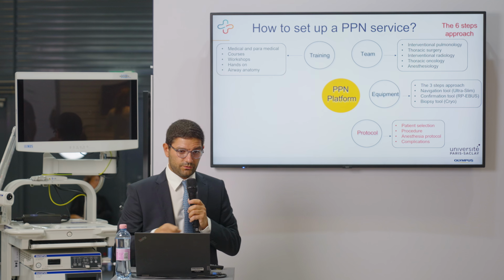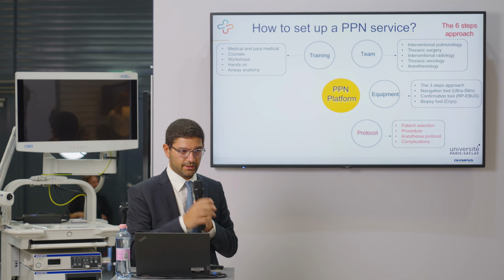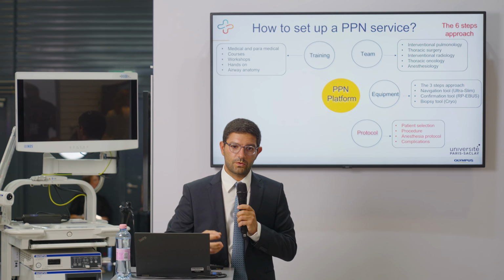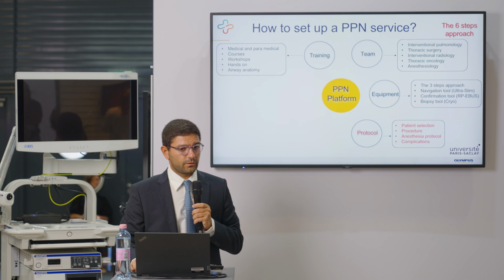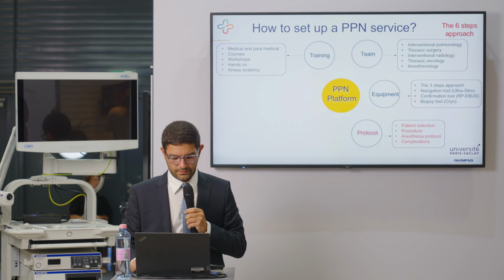You need to write down your protocols for patient selection, for the procedure, and the anesthesia protocol, because we know that anesthesia protocols play a major role in improving the diagnostic yield, especially when we use cone beam CT to improve the quality of imaging. And set your protocols for complications management, like bleeding or pneumothorax.